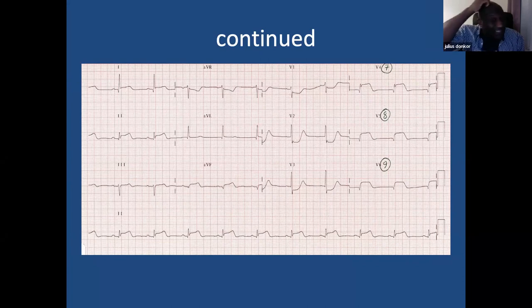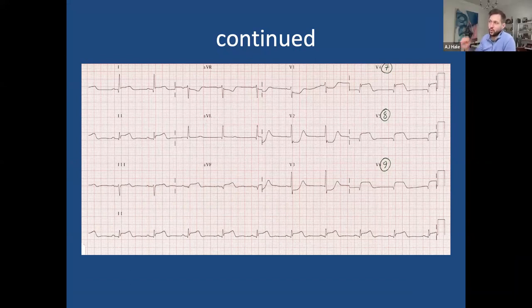Some books will say if lead two has a higher ST elevation, and this is the posterior ECG recording I was speaking about. I actually forgot I had it already. So you remove your V4 to V6, and then that becomes V7, V8, V9, and you can clearly see your ST elevation there. If you're doing a posterior recording, you can see your ST elevation there. So, is there a risk of false positive with V1, V2, V3 being negative, where you would need to do 7, 8, and 9? Or if you're negative in V1 through 3, is that a pretty strong indicator it's posterior?